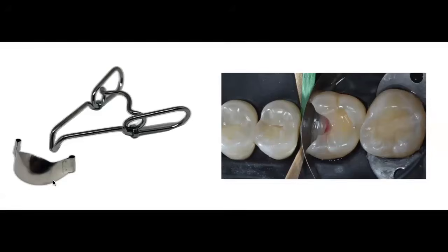Now, what I like about these bands is that they're very rigid, and because they are rigid, you can see that even though I've used multiple wedges to approximate the band to the remaining tooth structure, there's no alteration of the shape of the band.